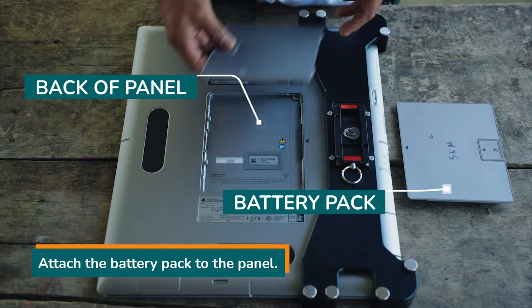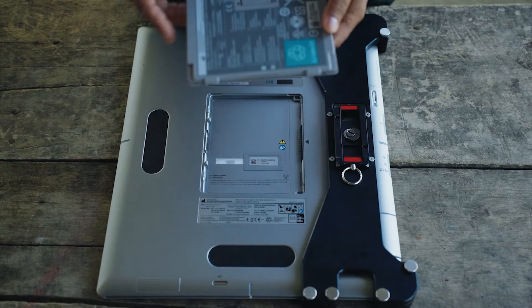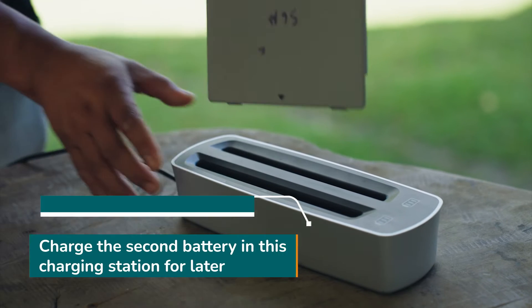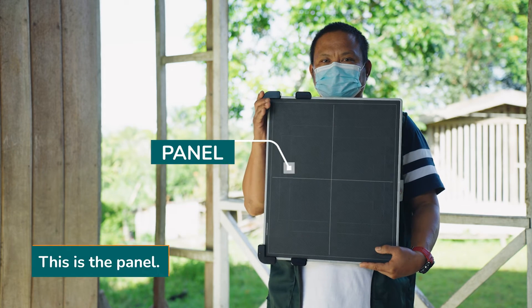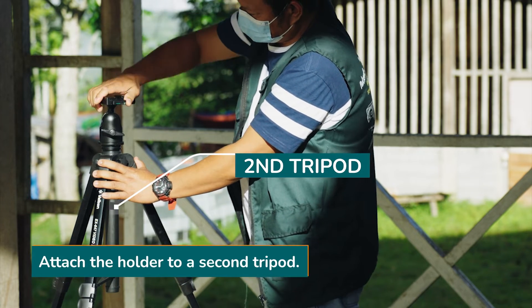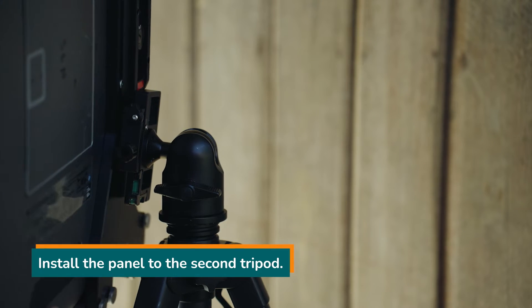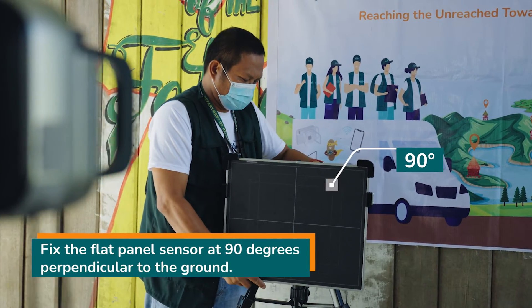Attach the battery pack to the panel. You can charge the second battery in the charging station for later use. This is the panel. Attach the holder to a second tripod and install the panel to the second tripod.